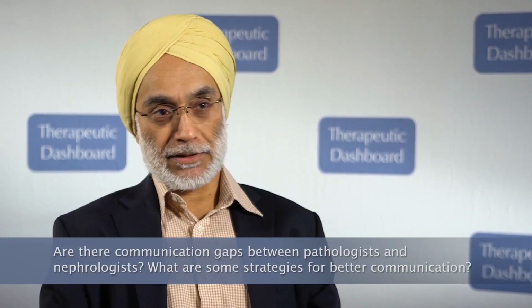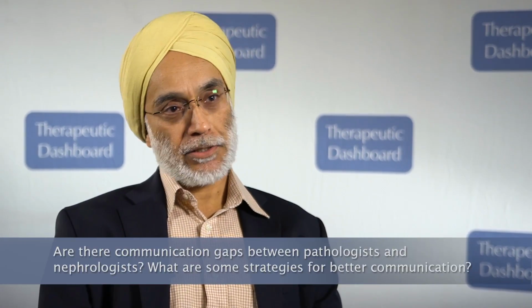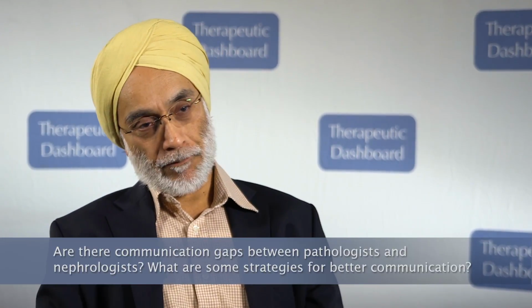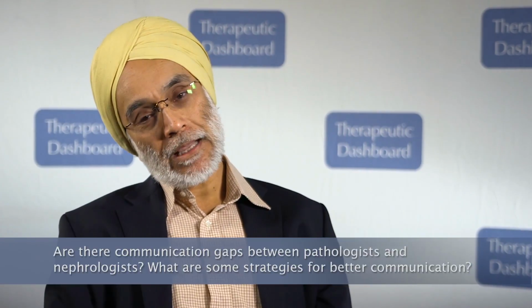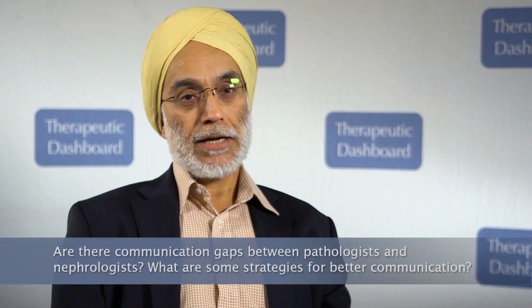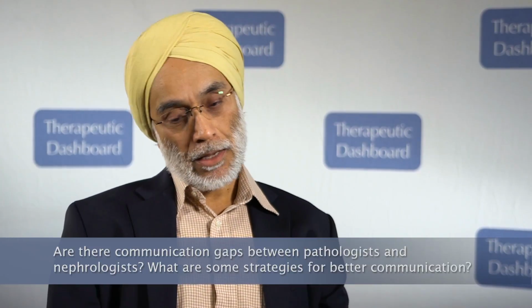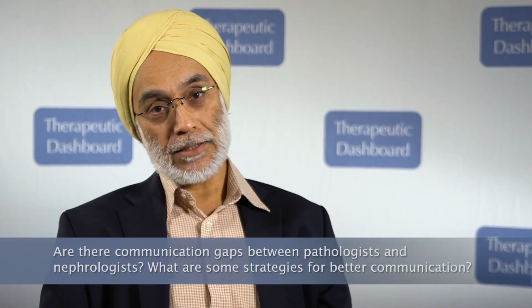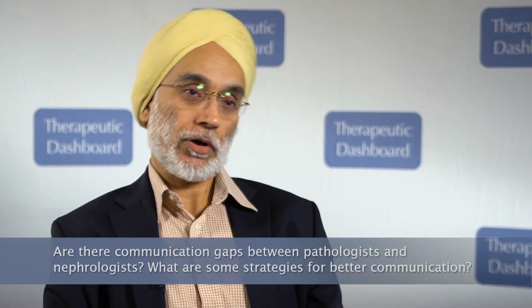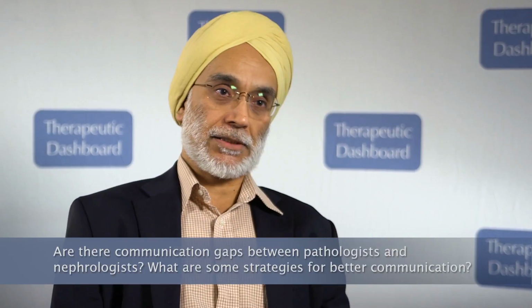cell mediated rejection, Banff grade 1A. A diagnosis number 2 might be severe chronic allograft nephropathy. Now, a busy nephrologist may read only the first line, for example, and say, oh yes, there's grade 1A rejection, I have to treat it. But if you were to read the second line, it's also saying there's severe chronic allograft nephropathy, which means that the kidney is close to the point where it needs replacement.